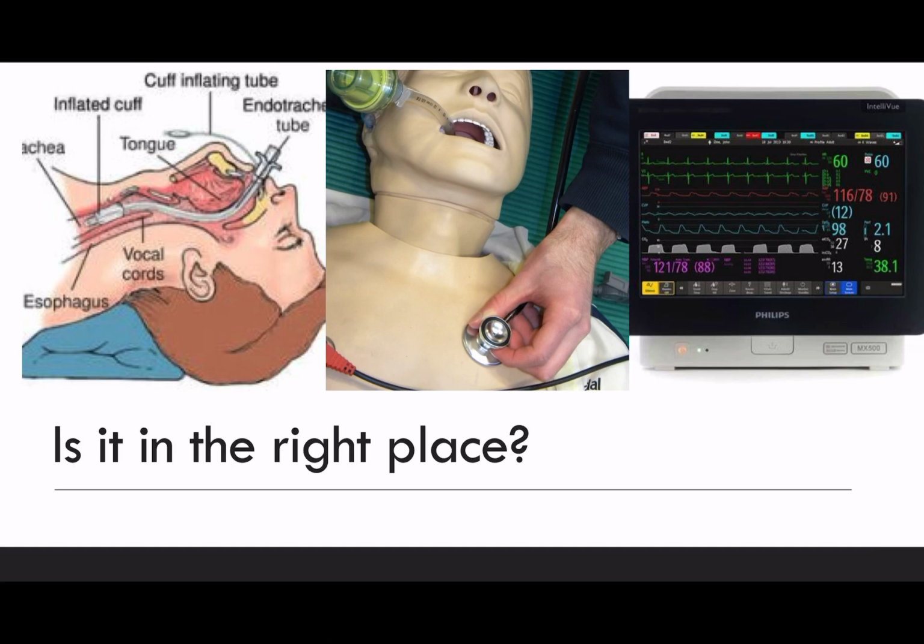Every single intubated patient should have end tidal monitoring with a trace. Be reassured if you see a good normal trace like you see with that monitor there, the tube is most likely in the trachea. Now there are some slight variations to that, but for the most part you can be reassured that this patient is being ventilated and the lungs are seeing the ventilator gas and exhaling that gas into the ventilator again.